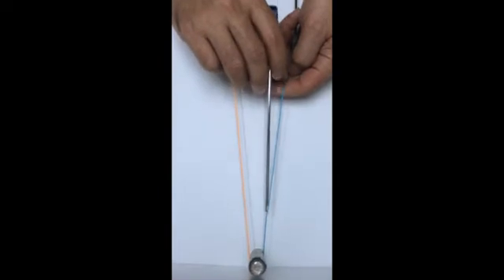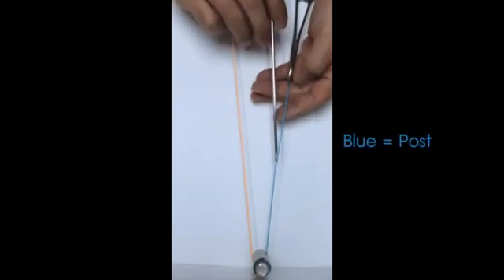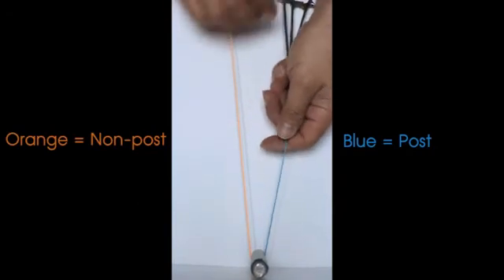For better understanding, the suture limbs have been color-coded as blue for post and orange for non-post or the loop limb.